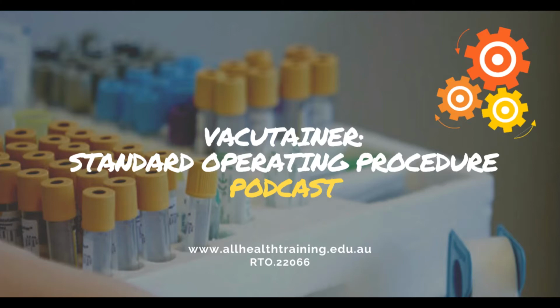Ensure that the patient is seated comfortably in the chair, and explain the procedure to them. Sanitize your hands, apply the tourniquet and palpate for the best vein. Once you have selected a vein, loosen the tourniquet and sanitize your hands again. Gather the equipment into your kidney dish.